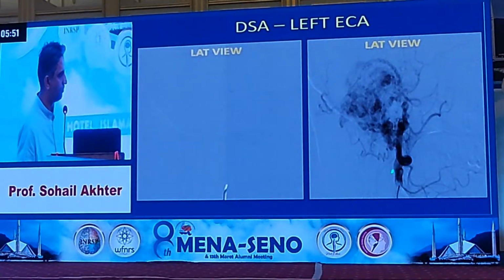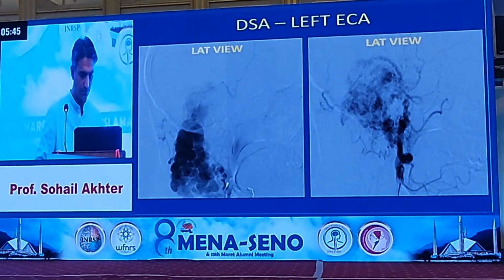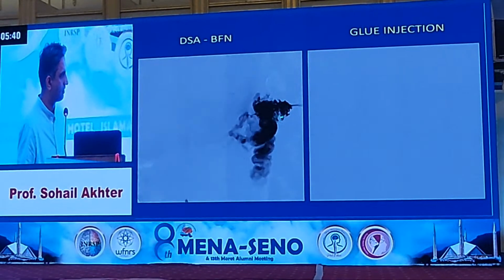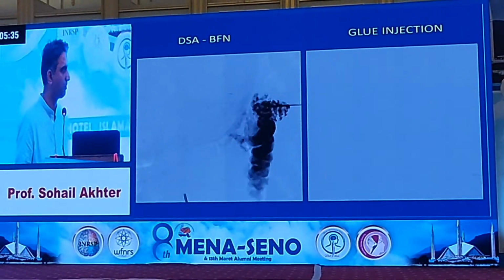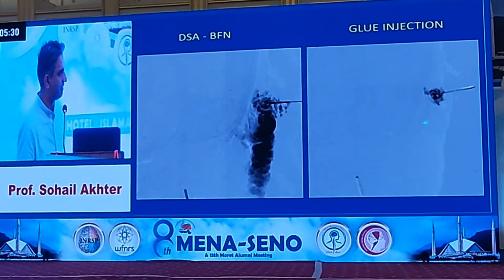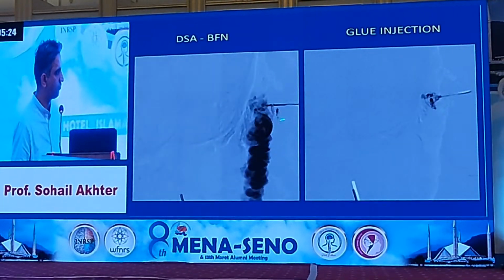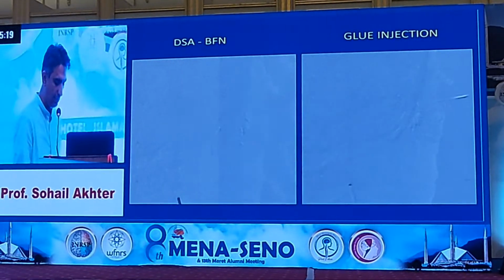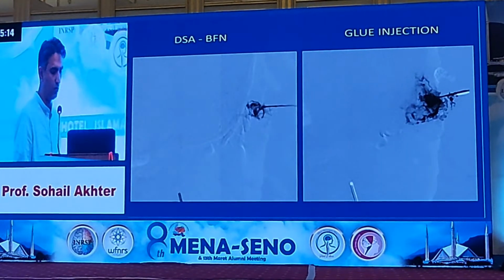These are the lateral views clearly demonstrating auricular feeders, STA feeders. So butterfly again, puncture done under ultrasound guidance at the pre-selected locations of the malformation. And it's the second run, and now the glue injection is being done. Just see how the glue pattern is following the nidal pattern, and it is so easy. We are doing it through percutaneous glue without any danger of our catheters or anything being stuck or inadvertent embolization to a different territory.